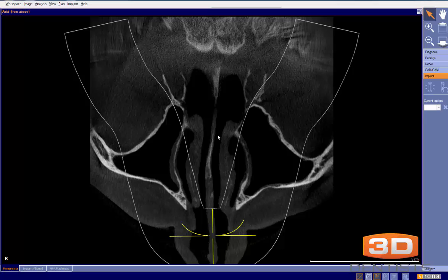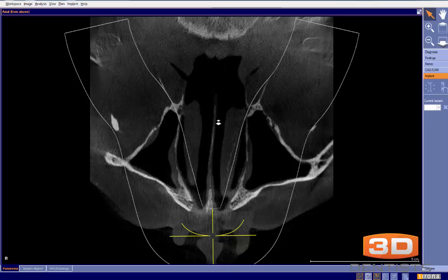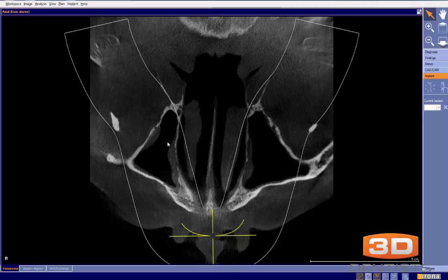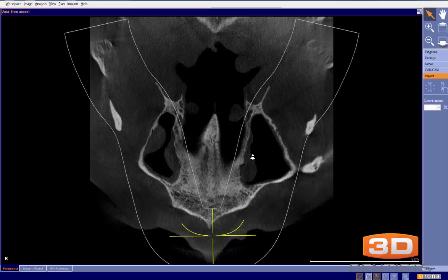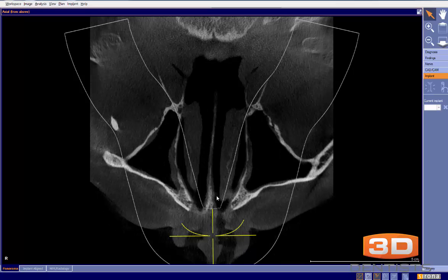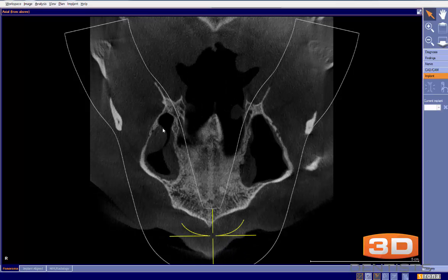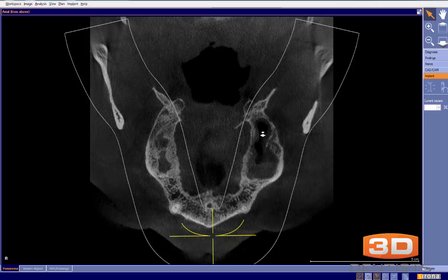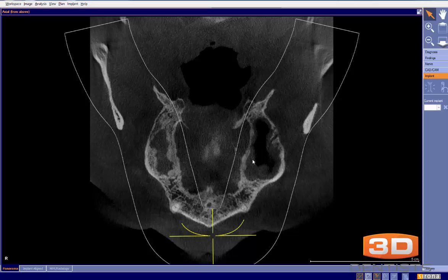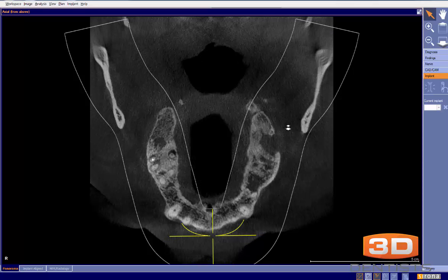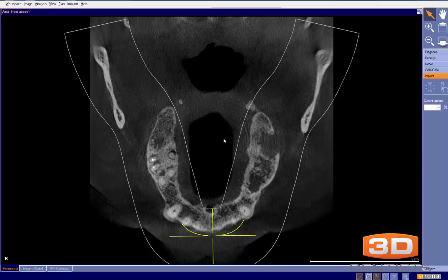What I'll notice here is we have a little bit of thickening on the left sinus, and then more so on the right-hand side — you can see it right there. We can also see a minor deviation, nothing overly concerning, but then I start really seeing more thickening on this right maxillary sinus. We can see it also on the left sinus, but more so on the right.